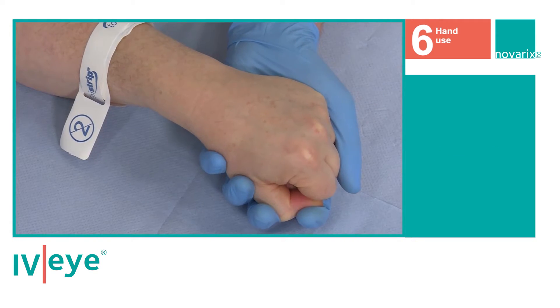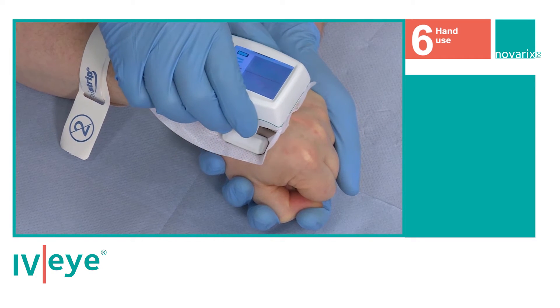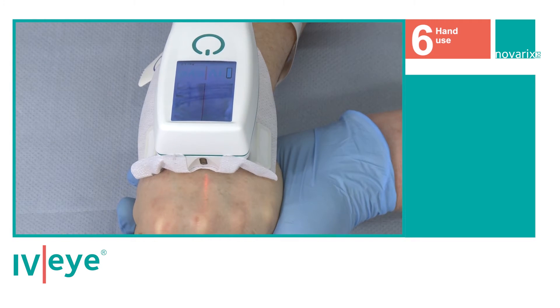Then, with the IVI powered on, place it firmly onto the back of the hand, making sure that the IVI and the red index light are pointing downwards towards the fingers.